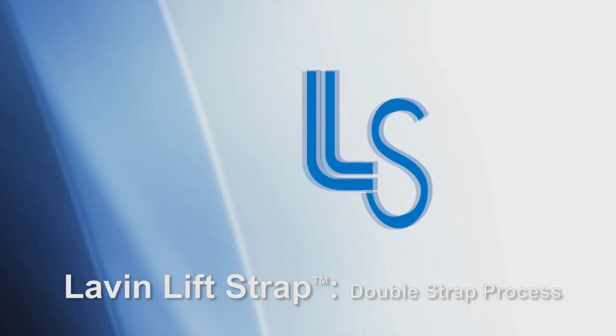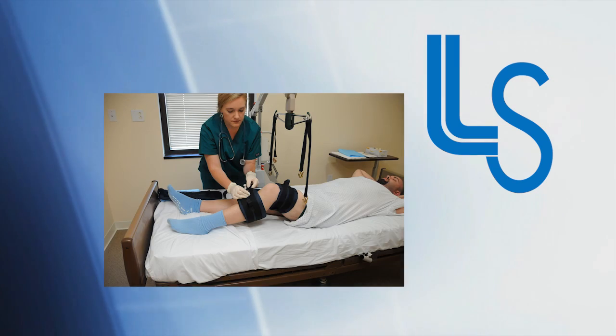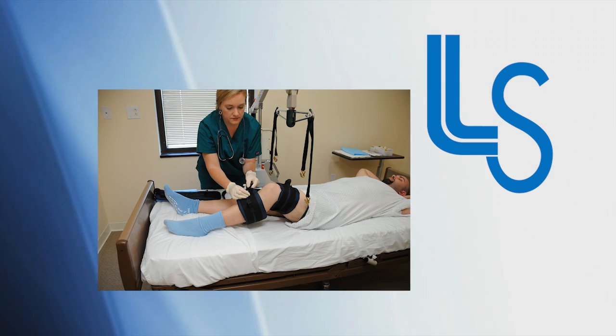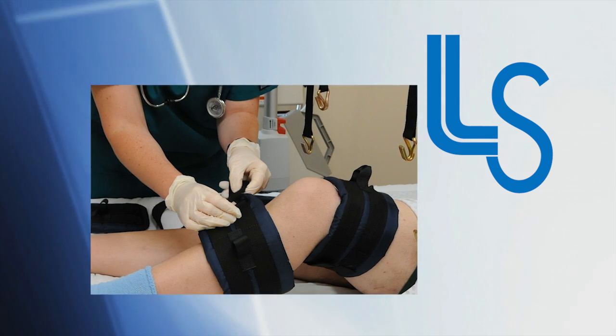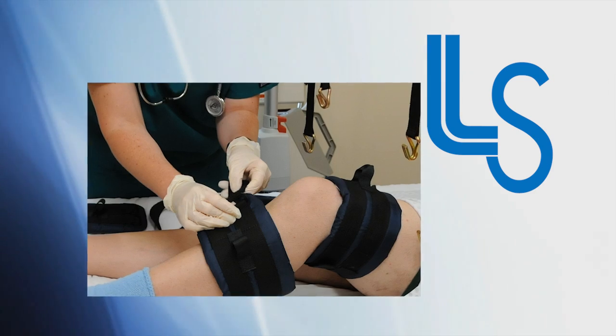Our double strap process provides the same benefits as our basic process. The double strap process has been designed for larger patients, or patients with very sensitive legs, such as those with varicose veins. The double strap process, using strap size to the patient's thighs and calves, distributes the stress points along the leg in these instances.